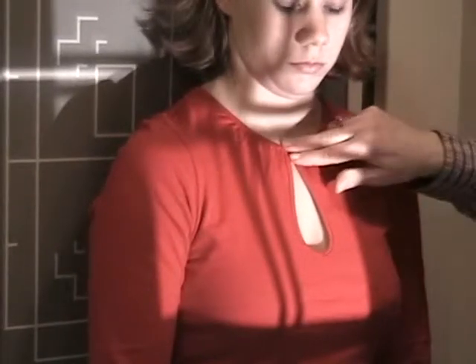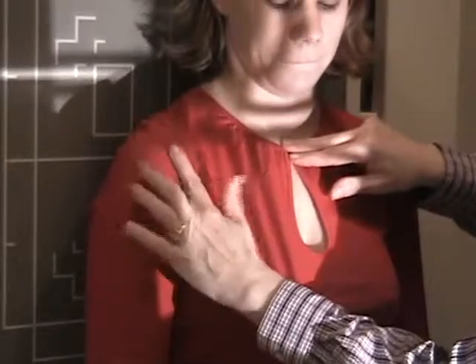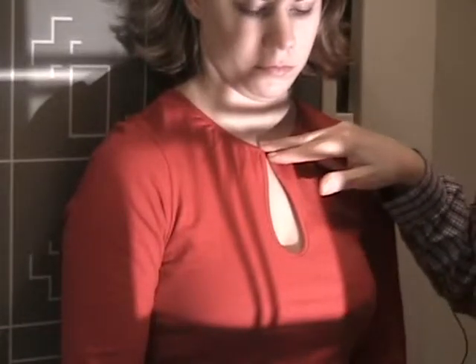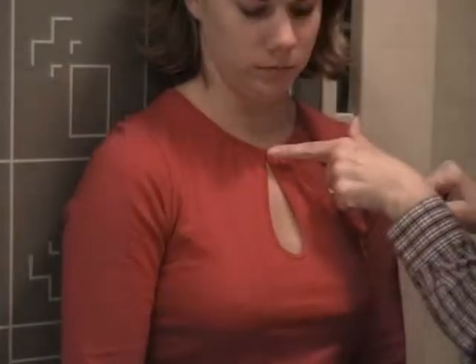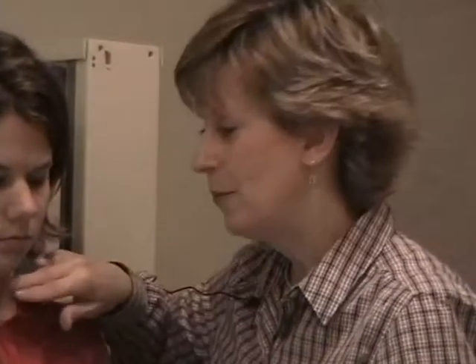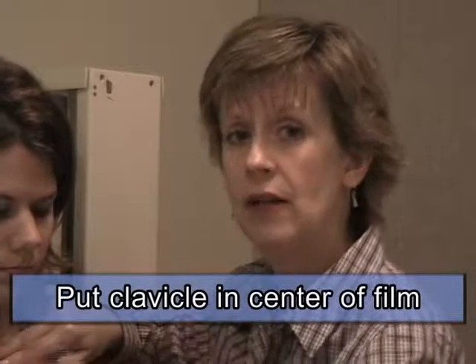Okay. And I want her arms to her side, or it can be held if that's her natural position. But the patient may have to move side to side, feet separated, in order to get this crosshair right down the center of that clavicle. So I like that side-to-side placement. The vertical placement, I have the sternoclavicular joint here, and if she was in a gown, you'd be able to see it. It will not be necessary for you to touch the patient. I'm touching the patient on camera because you can't really see what I'm trying to show you well on a digital image here. But in a gown, you will actually be able to see the boundaries of that clavicle. And basically what you're doing is you're putting the clavicle to the center of the film, both in a vertical relationship and a side-to-side relationship.